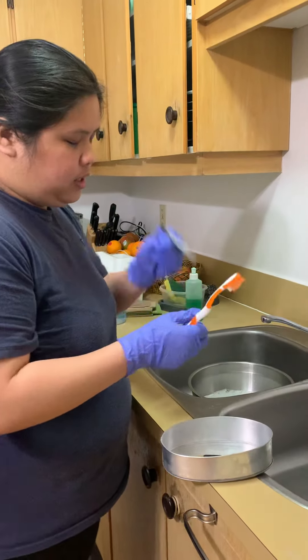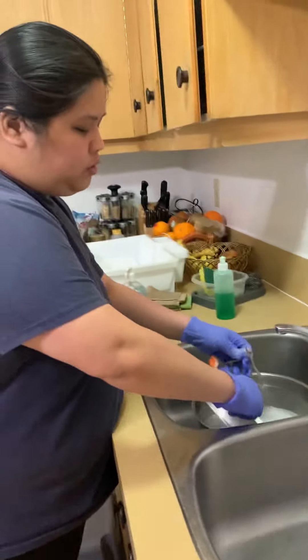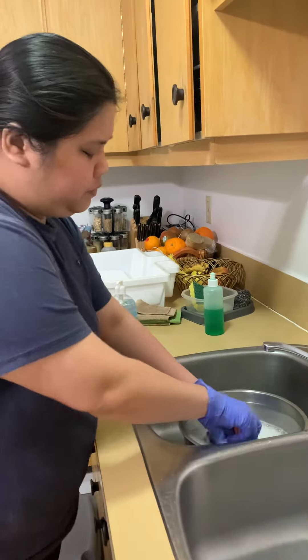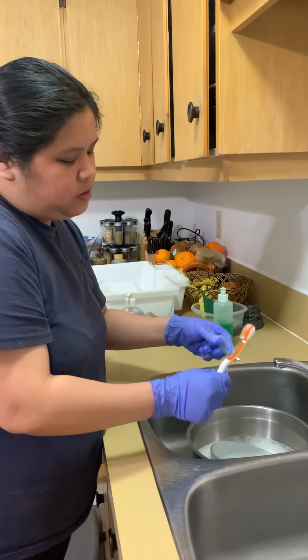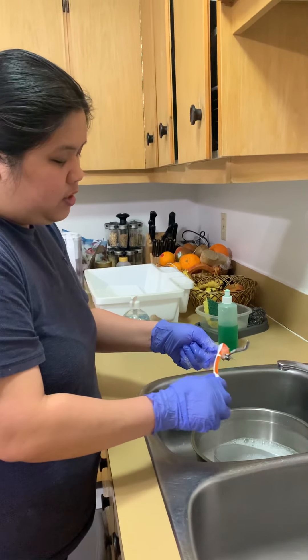Let's first clean the mosquito clamp. I'm going to soak it first. When cleaning the mosquito clamp, because it has hinges, you need to clean the hinges first.